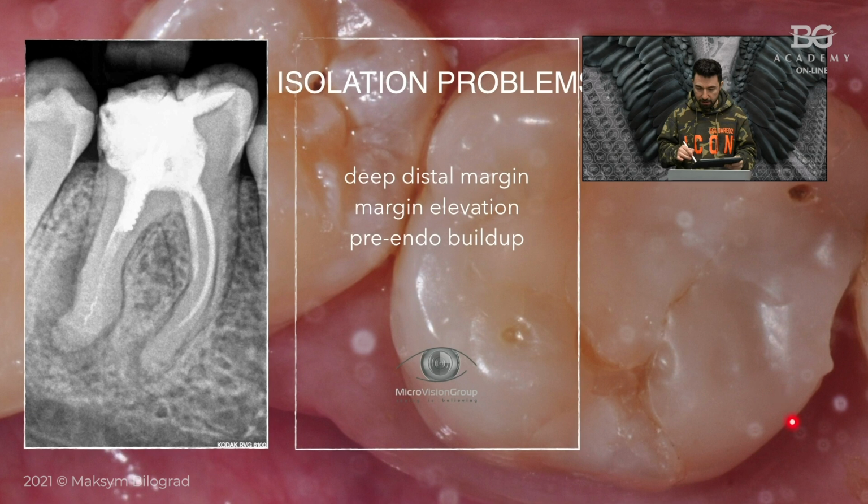As well, here we have a broken wall, and the filling itself is pretty big. We have cracks, and we have very thin walls.